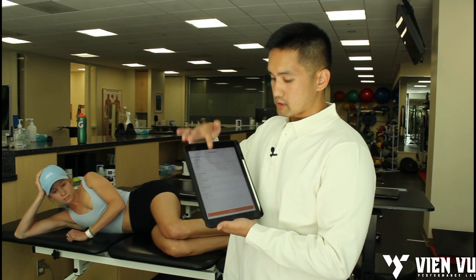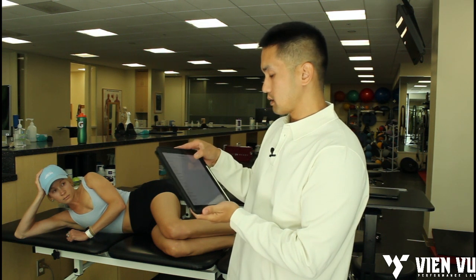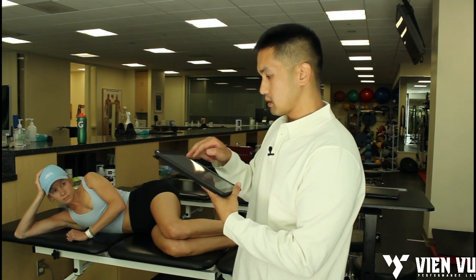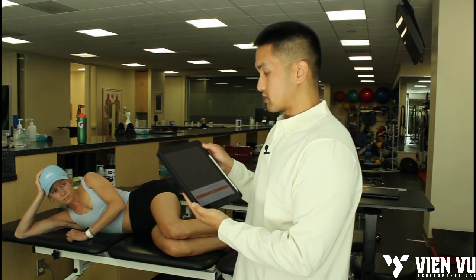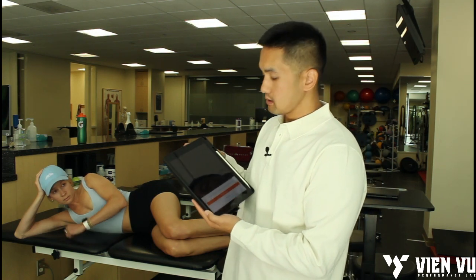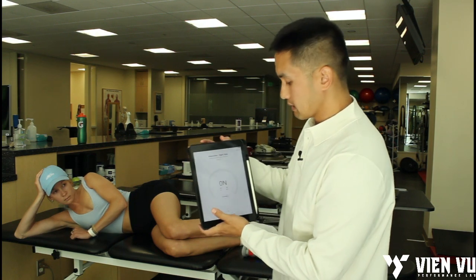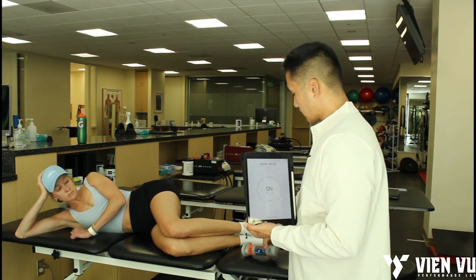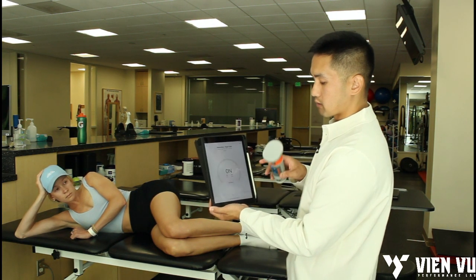I'm going to start, it runs you through the sequence. I'm going to select Profile — this is Ms. Stacy, so I'm going to look up her name. Found it. This is already starting on abduction right side. I'm going to click Start Testing, make sure nothing is touching those pads, hit Zero Device, and then we're good to go.